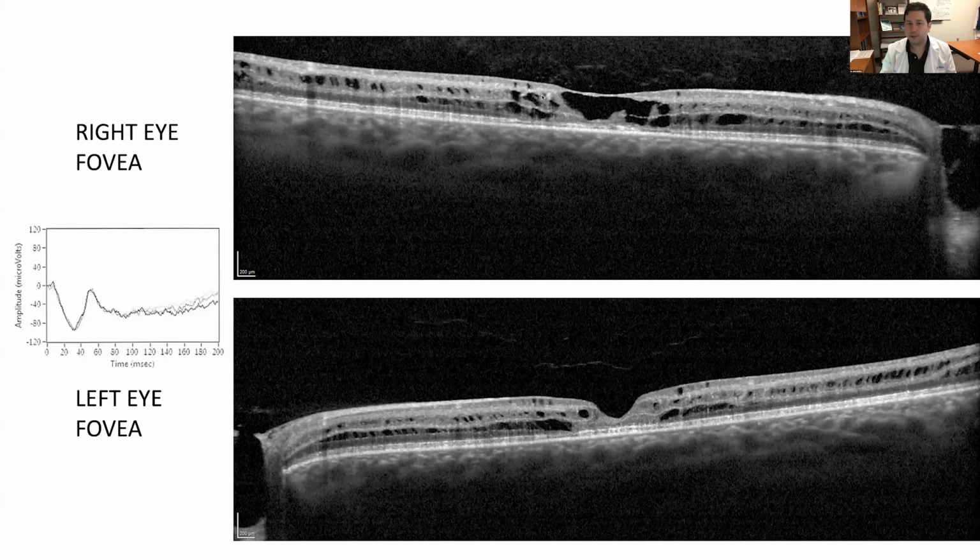The OCT shows us these schisis cavities within the fovea, the peripheral macula, and I show the example on the left of the full field flash ERG, the combined rod and cone response showing an electronegative response. The first downward deflection you see in that ERG is the A wave, showing a normal photosensitive A wave signal from photoreceptors. The B wave, which should normally rise up above the baseline, is severely attenuated. And so you see that the upward deflection never rises back above the level at 0 time. It never goes up high again. And that tells us there's dysfunction in the signaling between the photoreceptors and the bipolar cells. And that's reflected structurally in the schitic cavities that characterize this disorder.